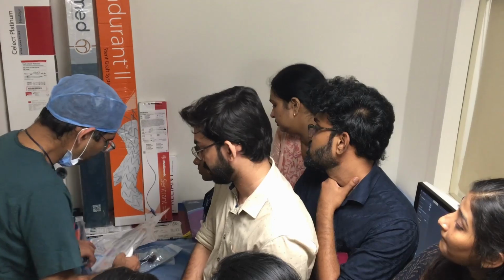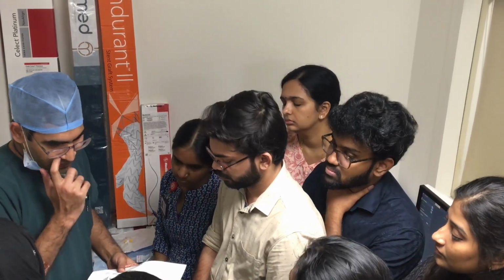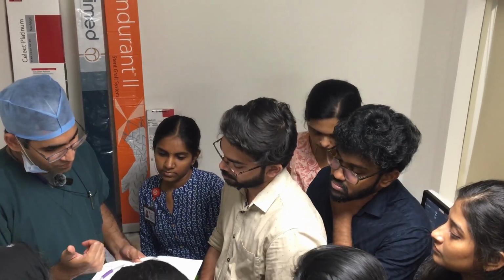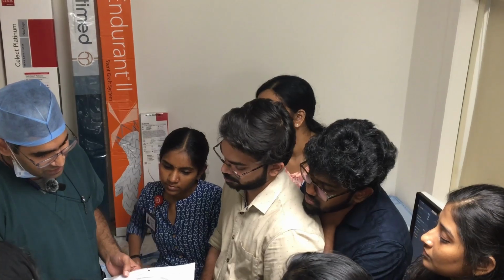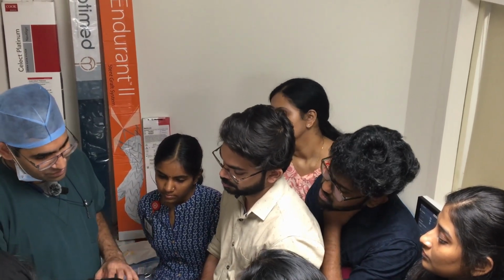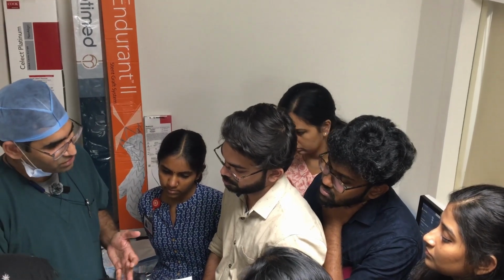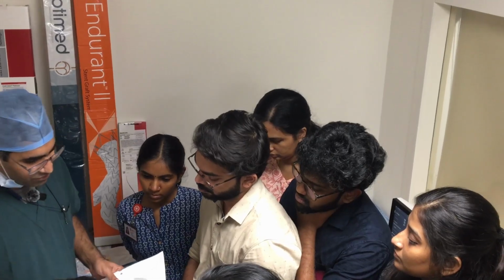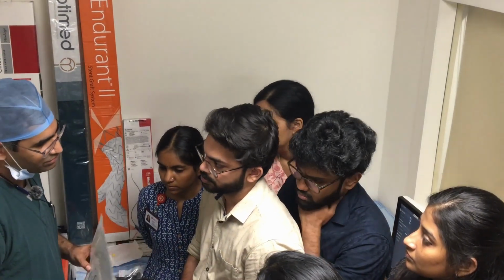So the wires are again, there are many types we discussed. Tip loading, how much support they have, and so these wires are typically for stability. So these are stiffer wires. They make the entire system stable. But this cannot be used for crossing a lesion because they are very tough, very hard. For crossing, we use softer wires. For stability, we use a different type of wires.